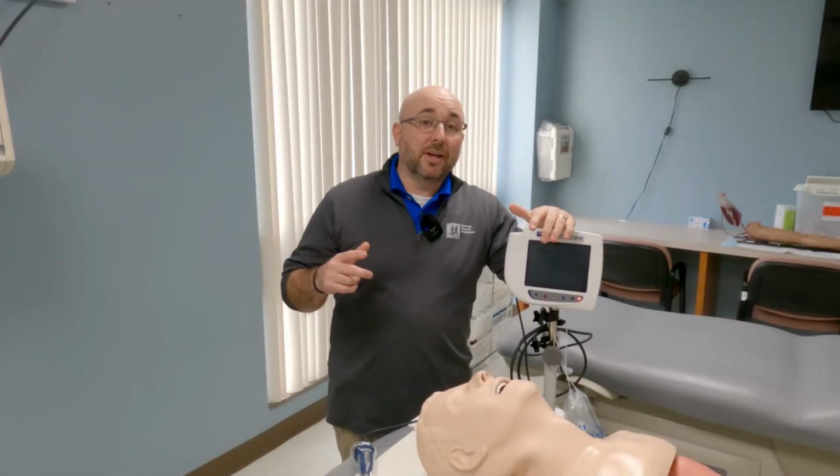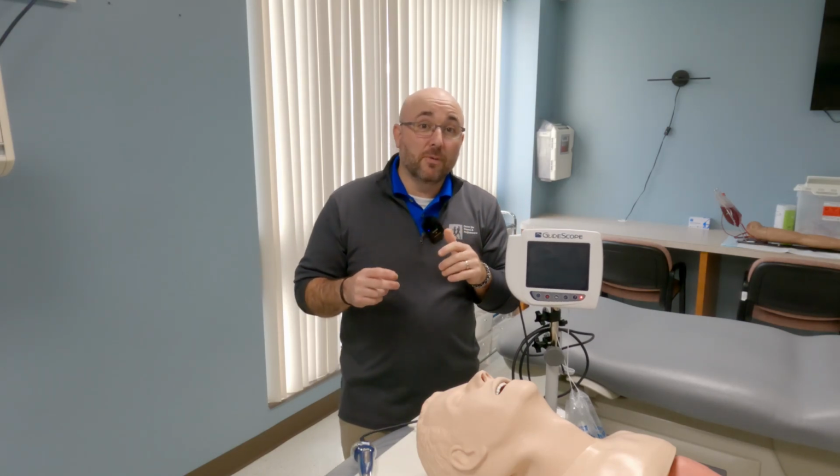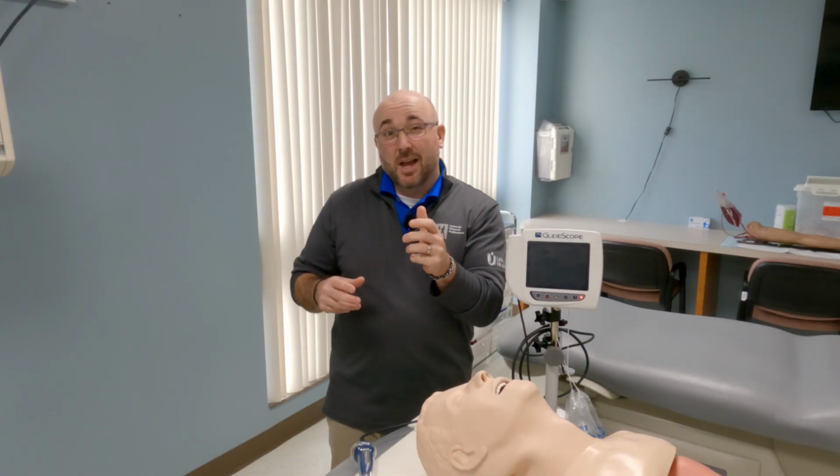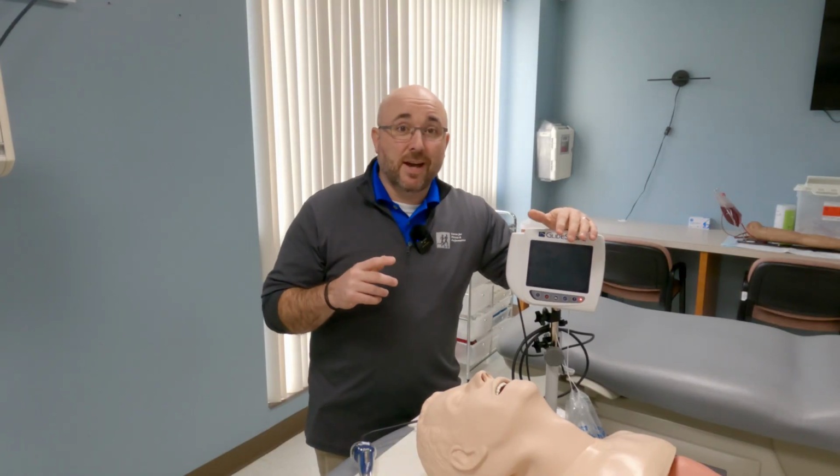So today we're going to look at video-assisted laryngoscopy. We're going to use a video system to intubate the patient. This is a little bit different than direct laryngoscopy, where we use a blade, which we have talked about in the past. This is one type of device. It's called a glide scope.